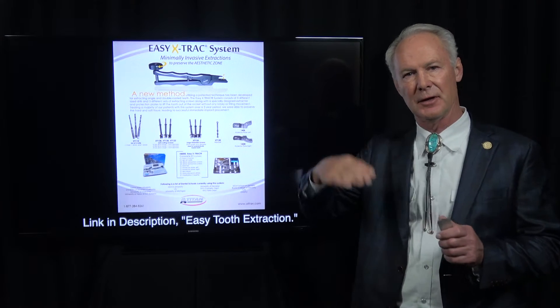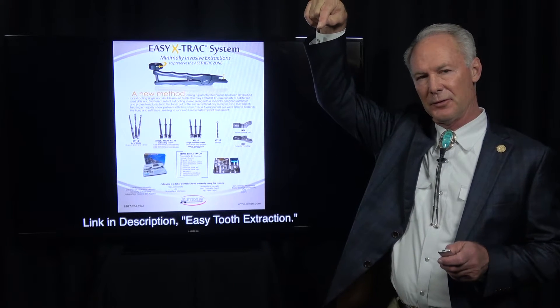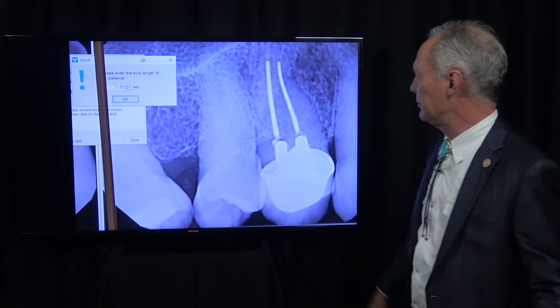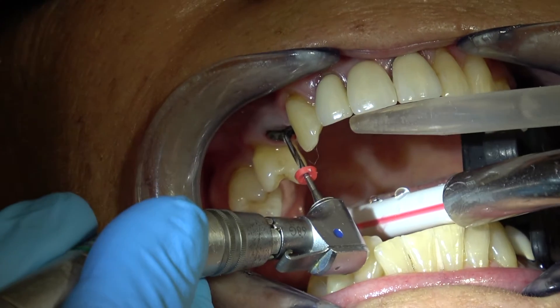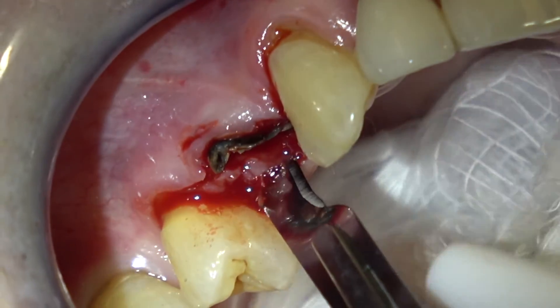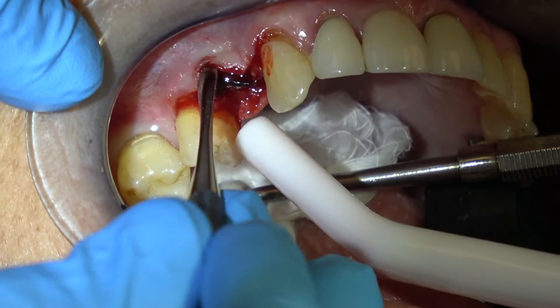In this case, much of the buccal — the facial bone — was already gone. But this system removes the root straight out of the socket so you preserve the facial and the lingual or palatal bone. I'm measuring the length of the tooth from the fracture to the apex. This is the first drill of the Easy X-Trac system, with an endostop so I don't penetrate very much past the apex. I'm reflecting the tissue just to see what the alveolar crest around the tooth looks like and whether it's intact.